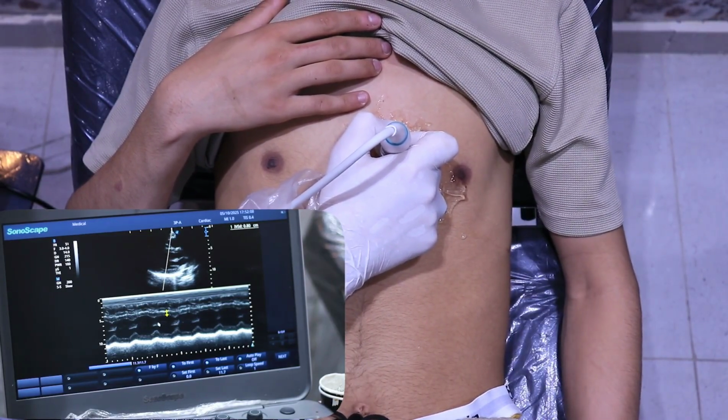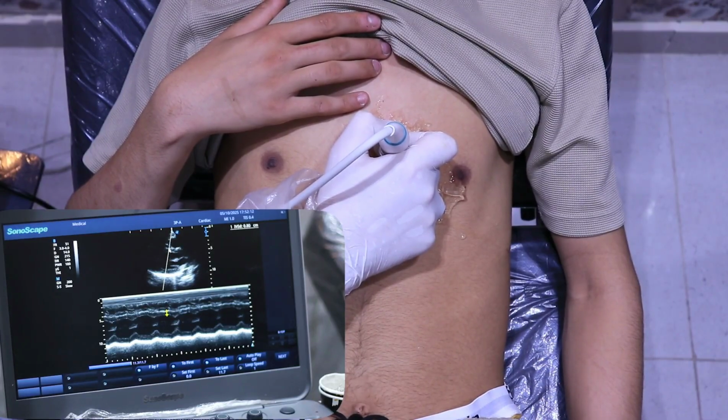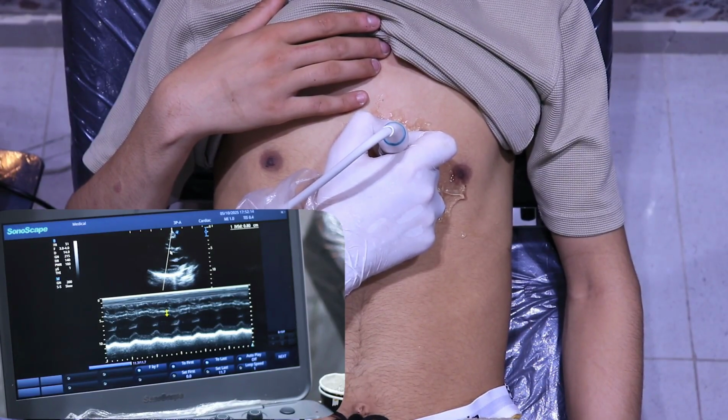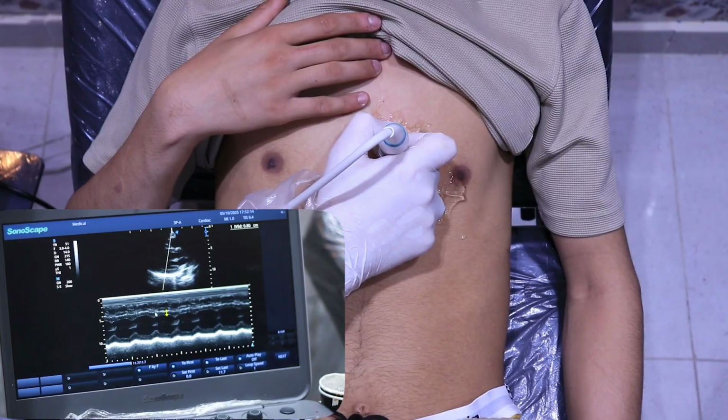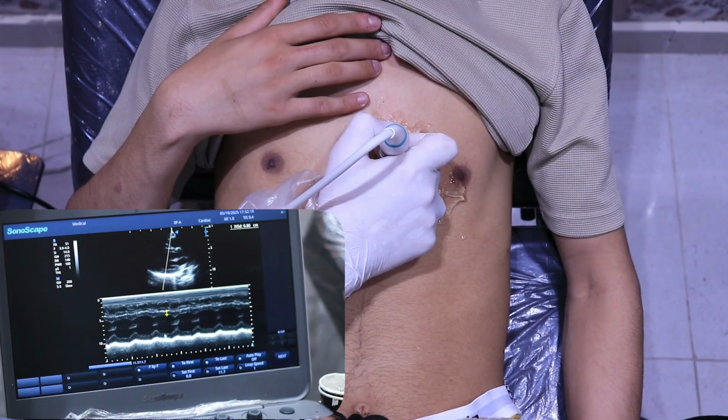مش كده؟ فاحنا لازم وانت في ال 2D you know what you are looking for. So this is the two lines of the septum. اللي هم فين؟ These are the two lines. And these are the two lines of the posterior wall.